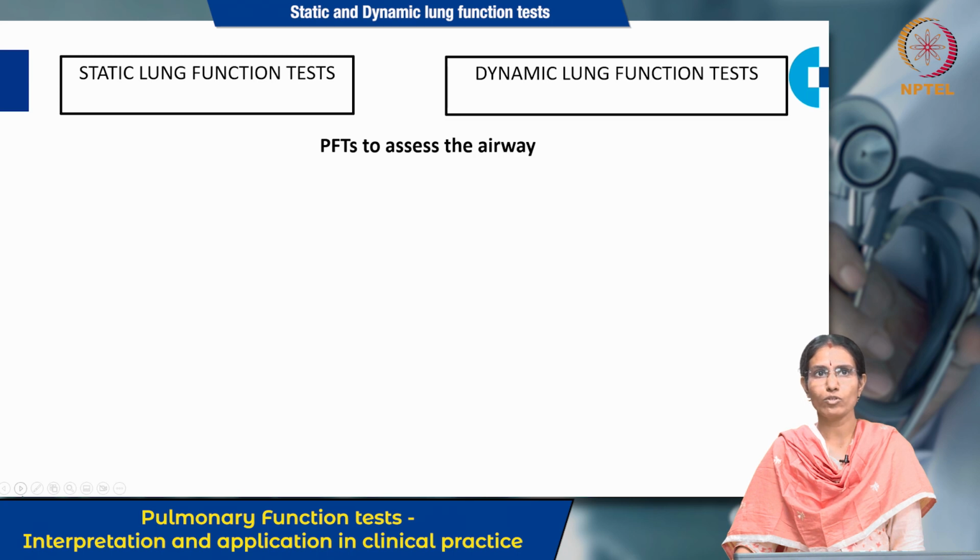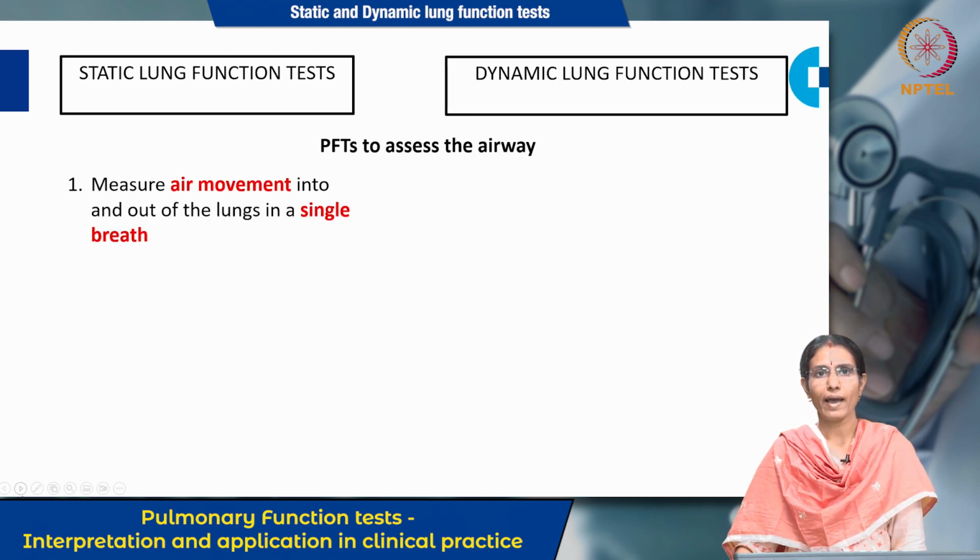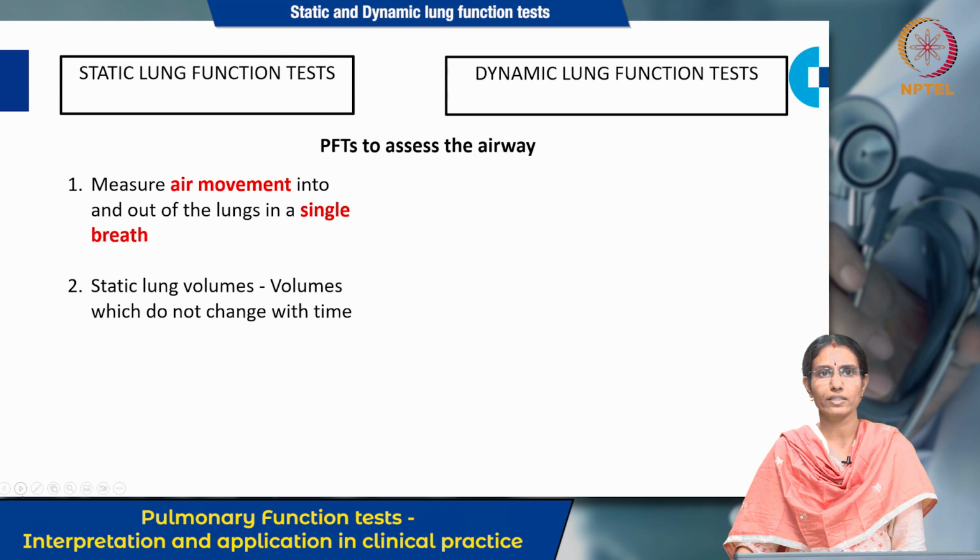So static means what? What does this measure? This measures air movement. Air movement into and out of the lungs in a single breath is measured using static lung function tests. And static lung volumes are measured using these tests. What are static lung volumes? Volumes which do not change with time.